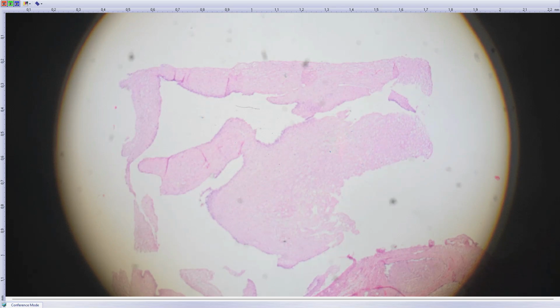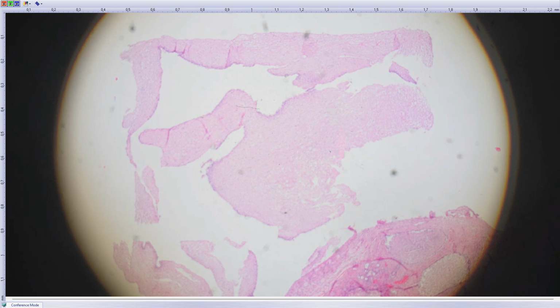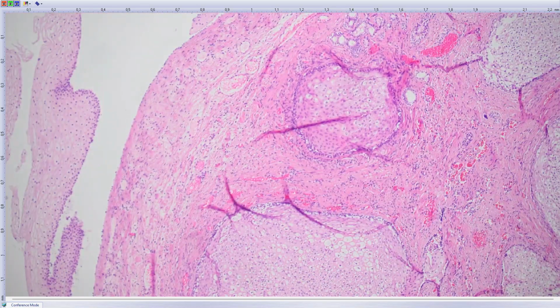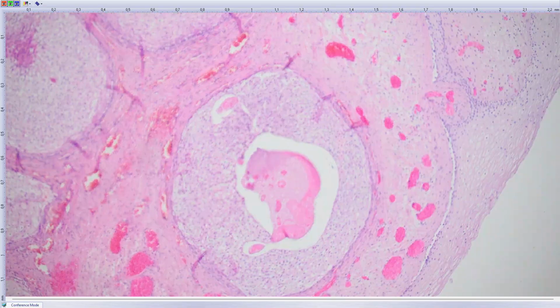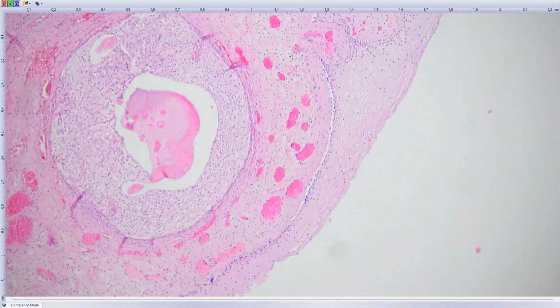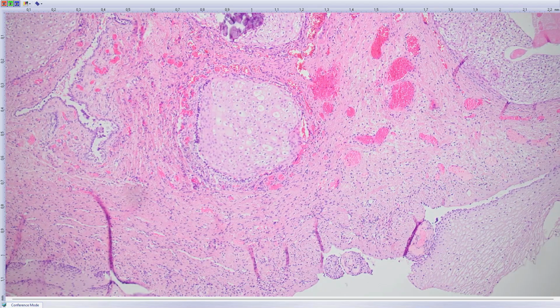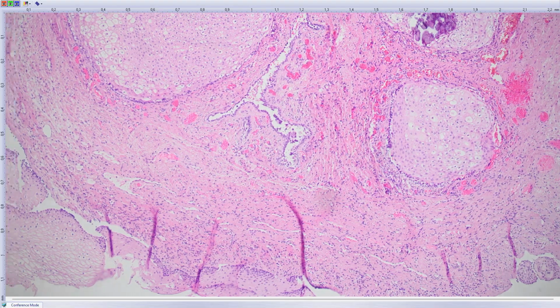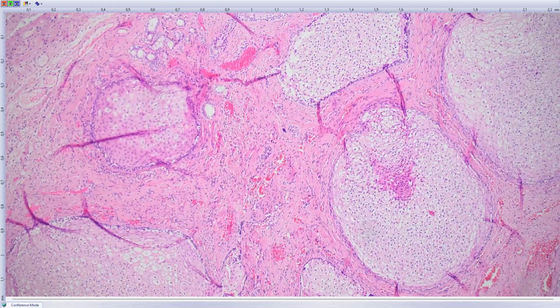And we see here fragments of the vaginal squamous epithelium with a lot of glycogen in it, and underneath you can see these nests again of squamous epithelium. The nests seem to be directly below the superficial mucosa, and there is one other component besides the spindle cell stroma, which is probably normal stroma in this area.